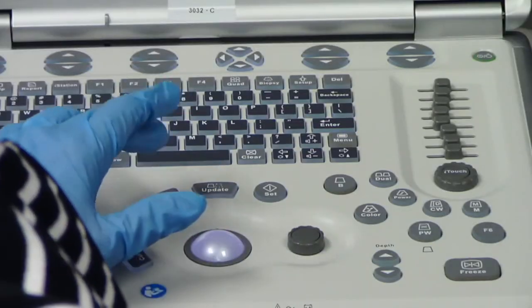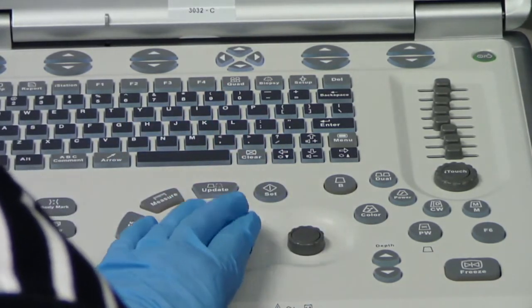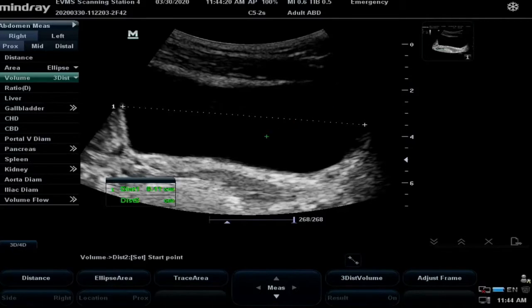and this time when I press measure and when I select volume again, it'll still give me that distance down here, that distance box, and I'm going to place 1 set of calipers here. And I'm going to take this image, and remember that is our save button, so I'm going to take this image, and what you may notice is we have our thumbnail over here. But what about the other distances I want? Well, the machine is going to remember that I'm trying to measure some distances.